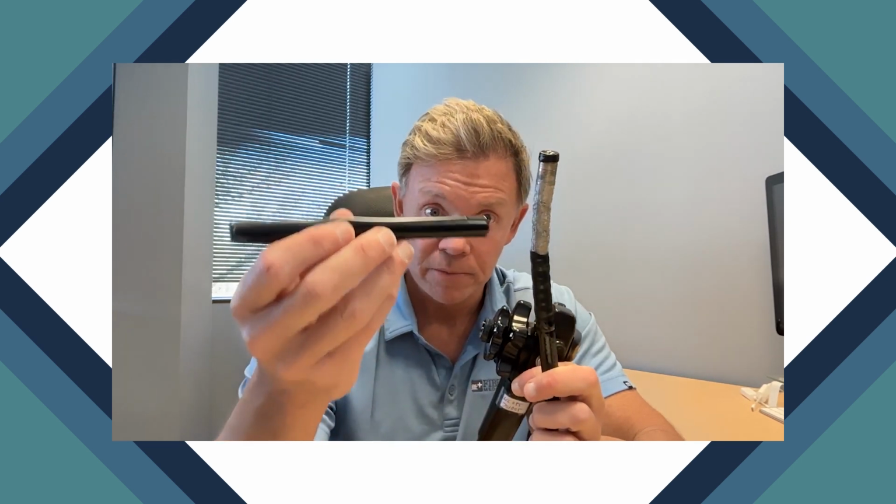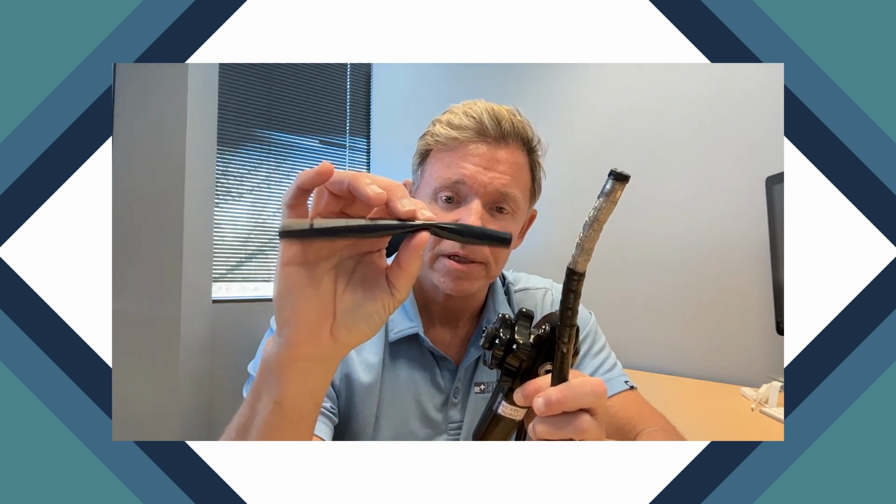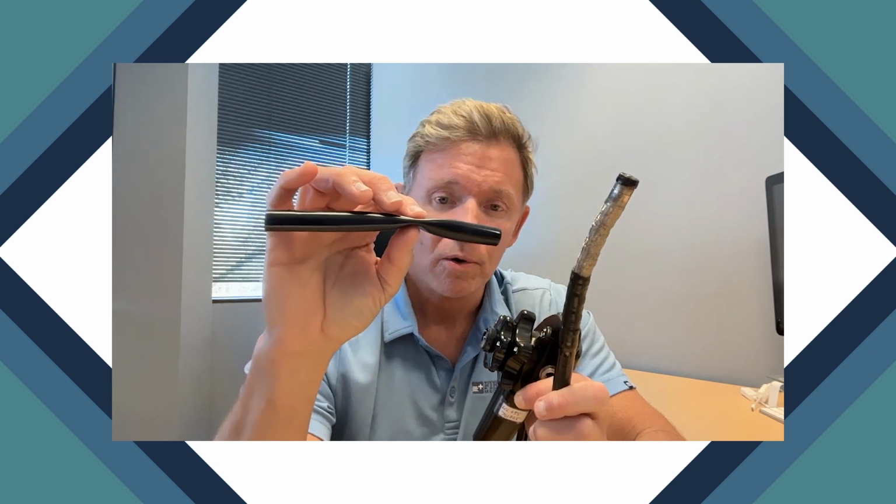This sheath is very fragile because it's thin, and it needs to be thin because if you put something on the tip that was thick, it would reduce the flexibility of the distal tip. So because of that, by the design of the scope, we're stuck having to put this thin outer sheath on there. This sheath is very prone to getting cuts, nicks, holes in it, and leaks in it. So during the leak test procedure that every facility should be doing after every case, this is a common area of the scope that they will find an external leak.